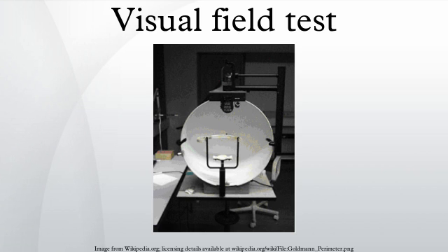An examiner presents a test light of variable size and intensity. The light may move towards the center from the perimeter, or it may remain in one location. The Goldmann method is able to test the entire range of peripheral vision, and has been used for years to follow vision changes in glaucoma patients. However, now automated perimetry is more commonly used.